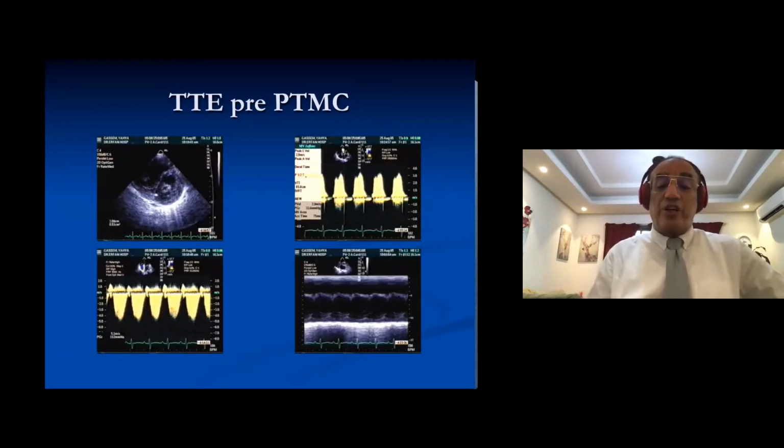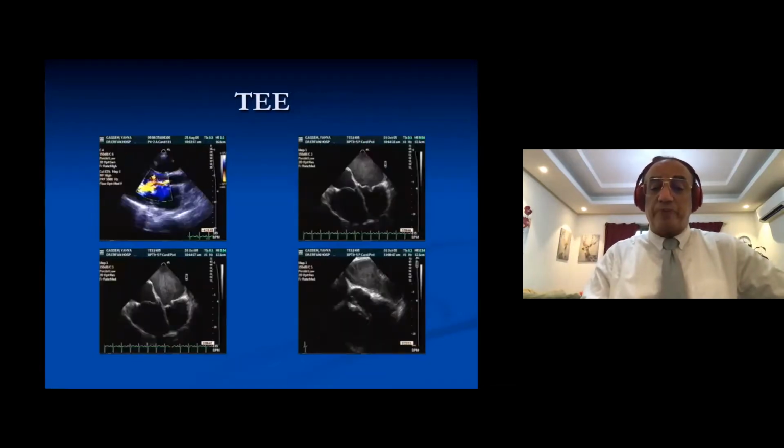And severe tricuspid regurg. And I can tell you the pulmonary artery pressure of this guy is around 100 millimeter mercury, exceeding the systolic, because the systolic pressure of this patient was 90. Look at the left ventricle here. The left ventricle is of normal dimension, but reduced function. And the explanation here is that there is no stroke volume coming from the left atrium to the left ventricle. So we call it disuse atrophy, or disuse decrease in left ventricular function.